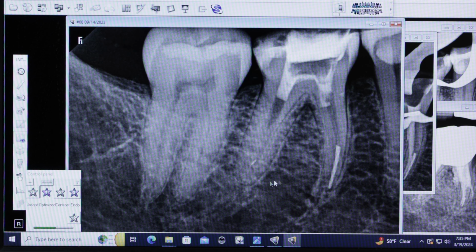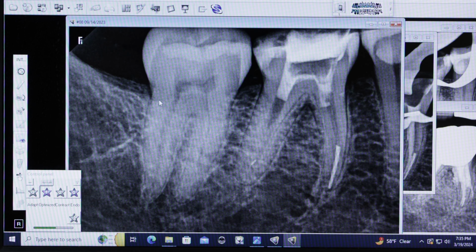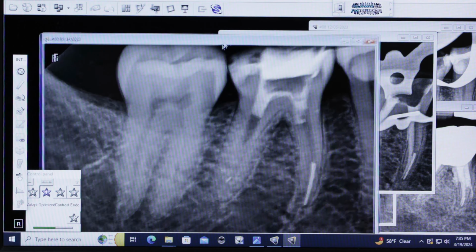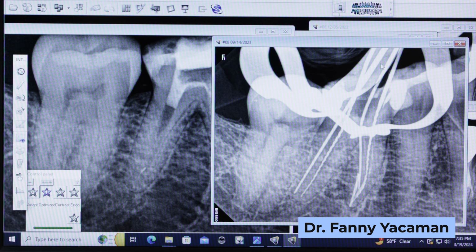So during a root canal, as you know, what we do is we open, then we measure the roots. And what do I mean when we measure the root? If we are measuring the root, we're gonna have an instrument that is called a file. And these instruments are gonna measure from the crown of the tooth to the end of the root.